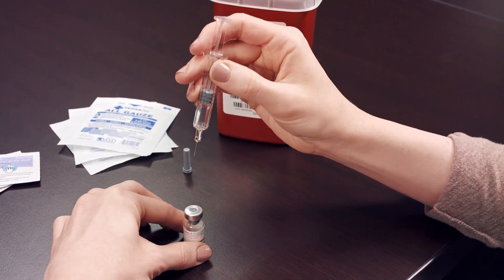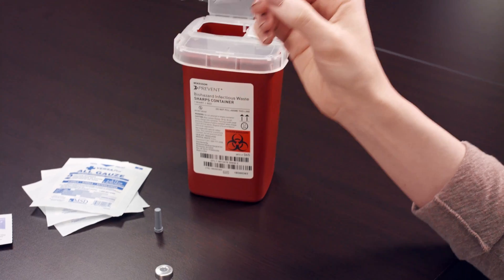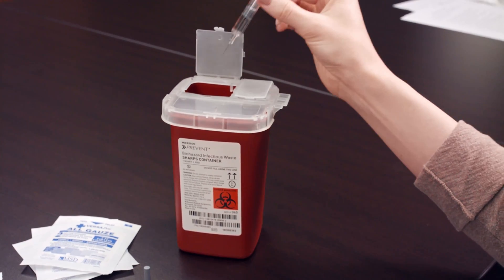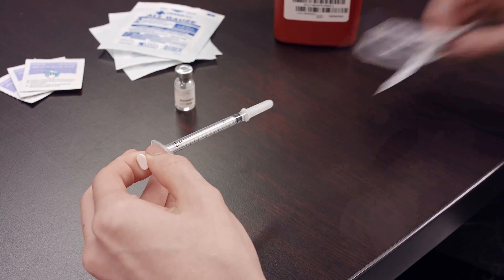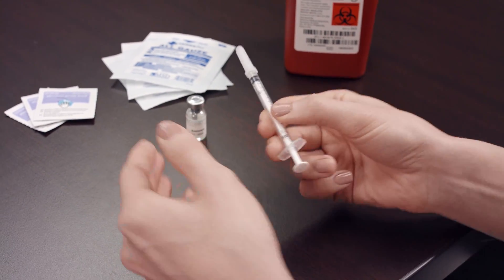Carefully withdraw the syringe from the vial. Dispose of the used syringe into the sharps container. Remove the custom dose injection syringe from its packaging and remove the cap.